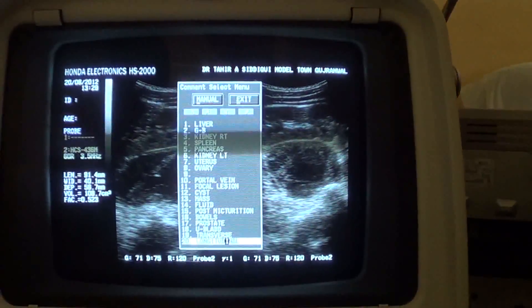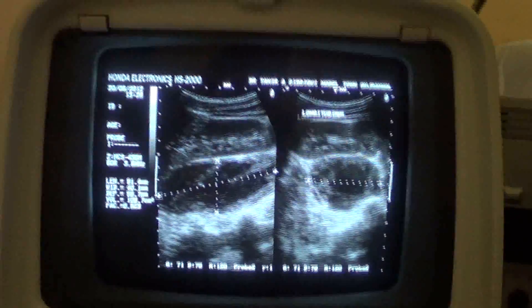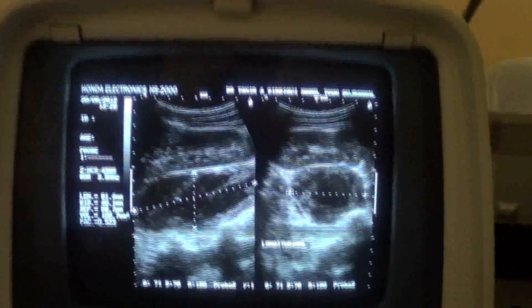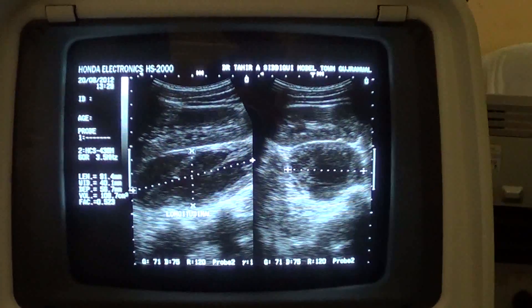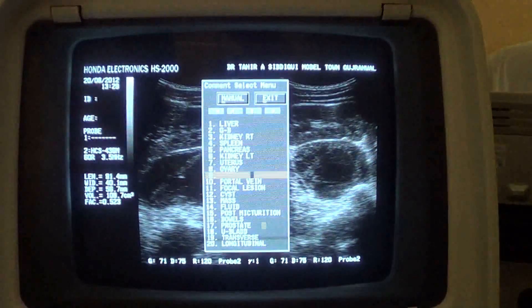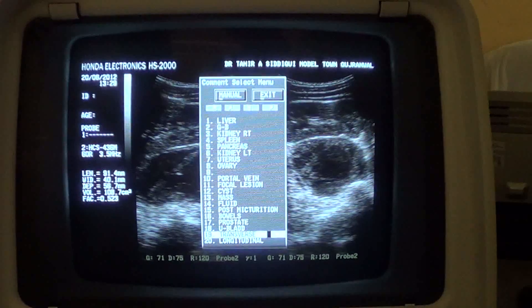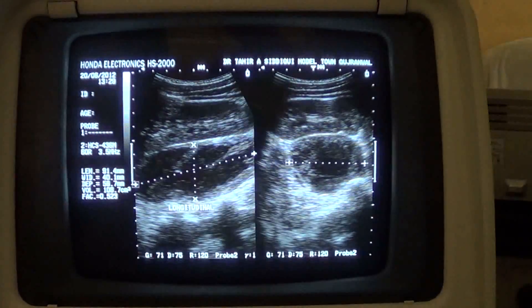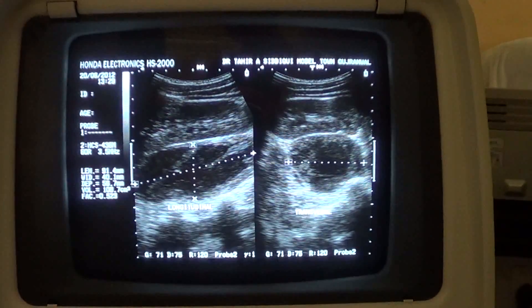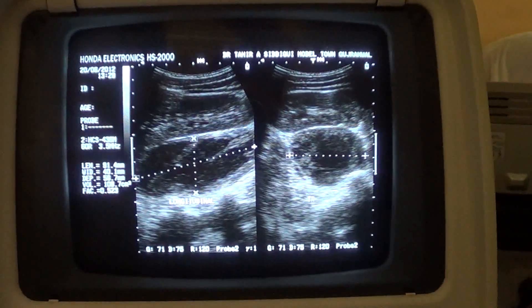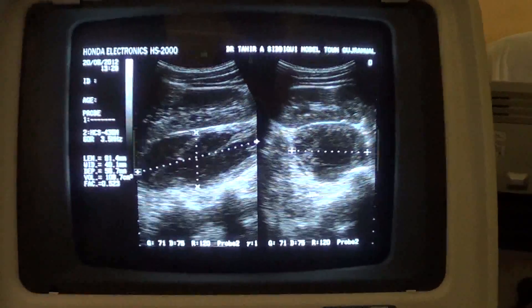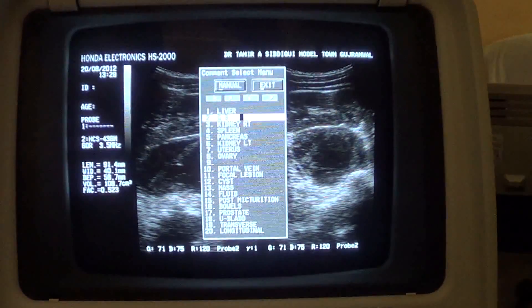This is the longitudinal section and this is the transverse section. Note the posterior acoustic enhancement. This is the right kidney.